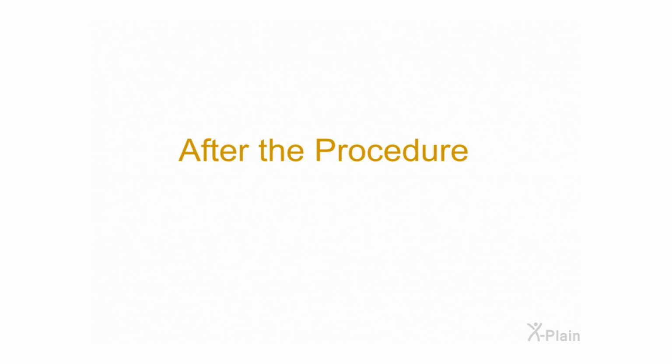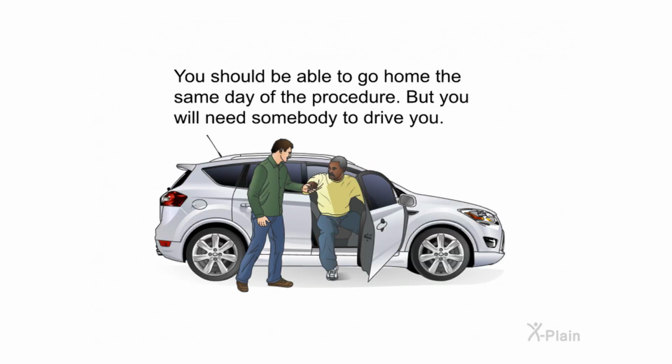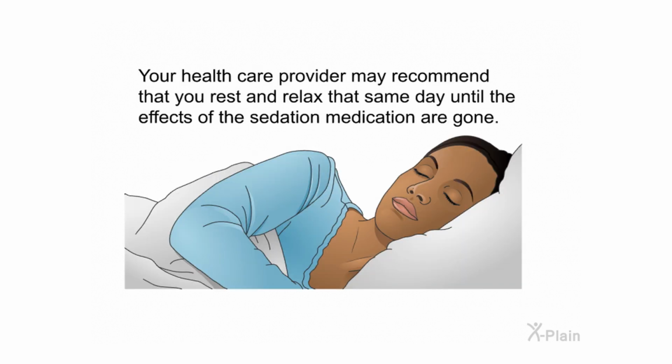After the procedure, you should be able to go home the same day of the procedure, but you will need somebody to drive you. Your healthcare provider may recommend that you rest and relax that same day until the effects of the sedation medication are gone.